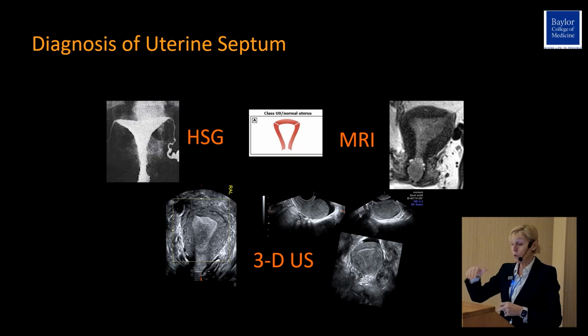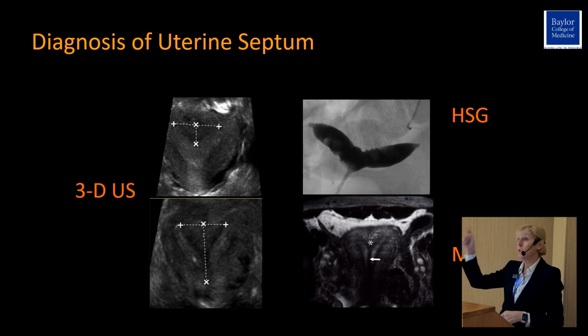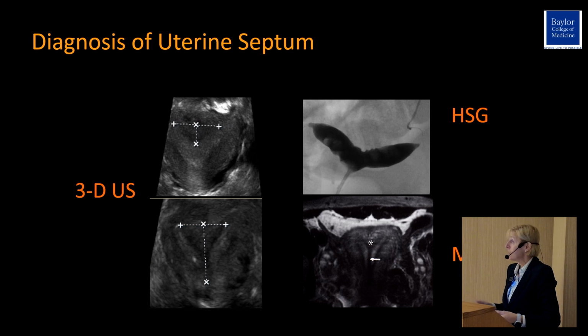For instance, if you have a uterus that is not aligned with the 45-degree angle of the MRI evaluation, you will not be able to see the internal and the external contour of the uterine cavity at the same time. And so most of the time the MRI will not give you a good diagnosis, and in the specifics it will not be able to measure the septum accurately.